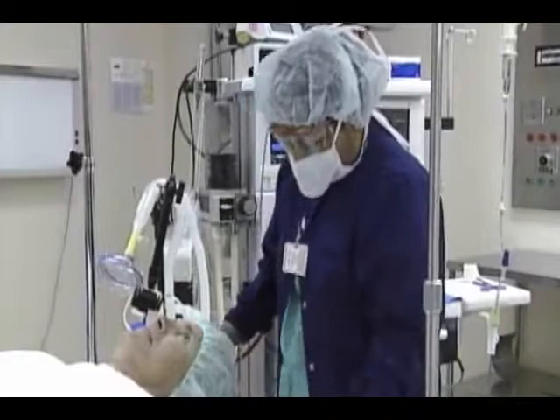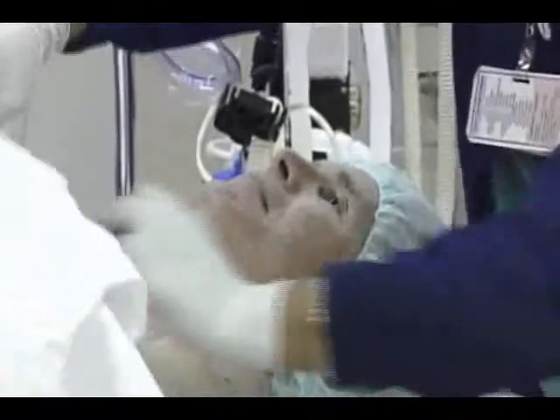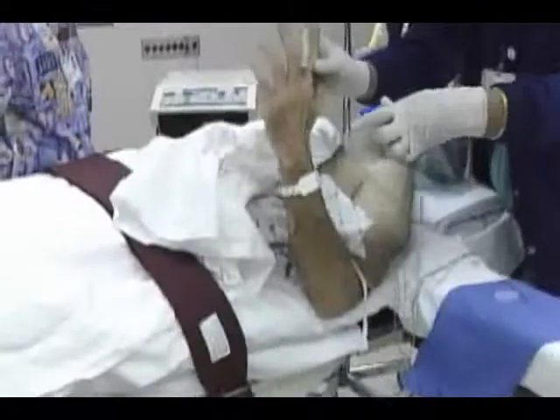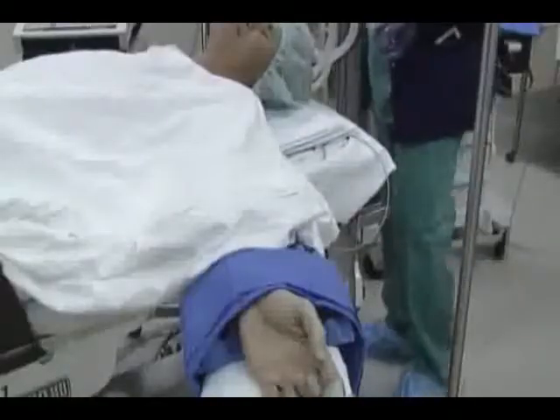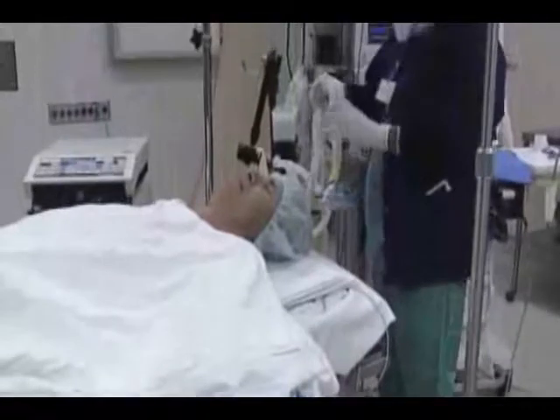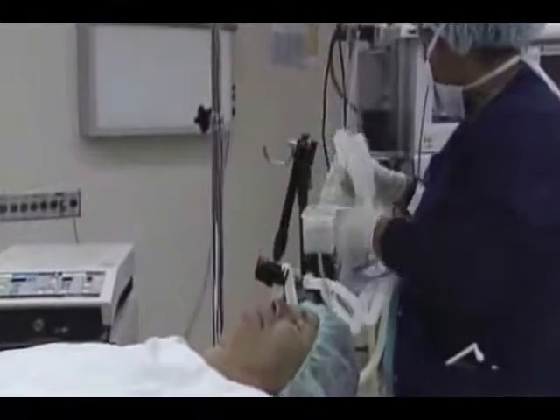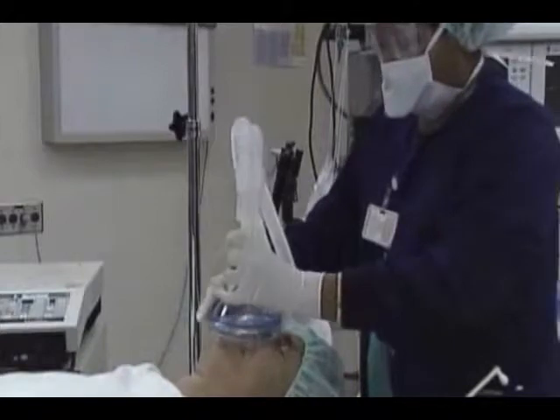I'm going to put leads on your chest. It's a little cold. Bear with me. The anesthesia care provider will use a variety of monitors to assess the patient's physiological responses and will document them throughout the surgical procedure. Okay, can you keep your arm right here? Okay, Mr. Smith, I'm going to put an oxygen mask on your face, okay? It's a clean oxygen air to give you a little more oxygen in your lungs, okay?